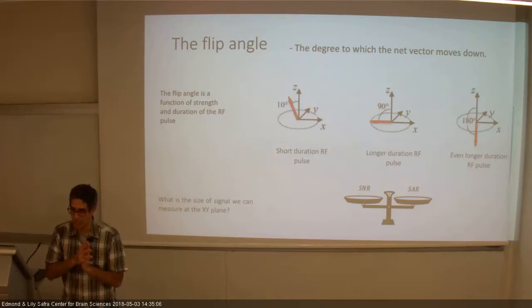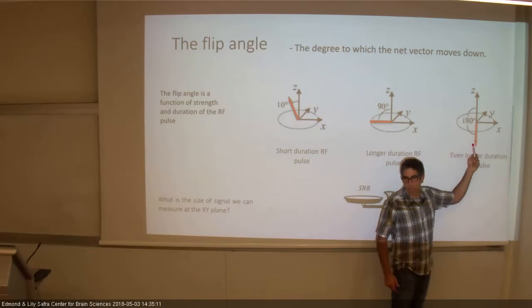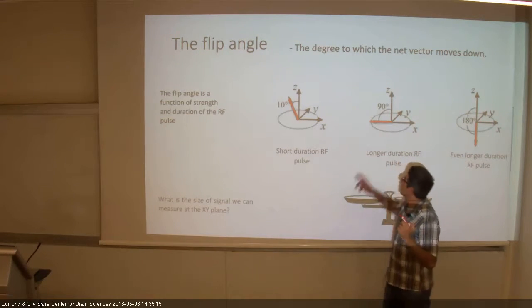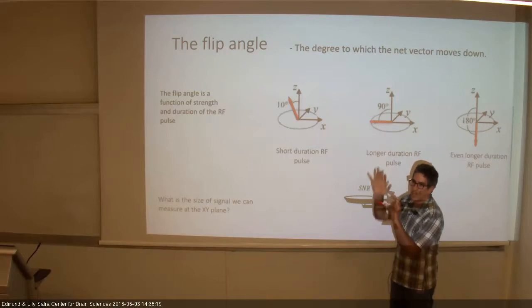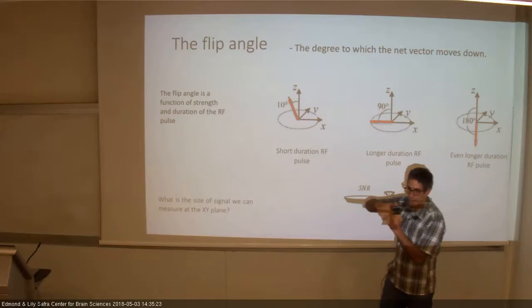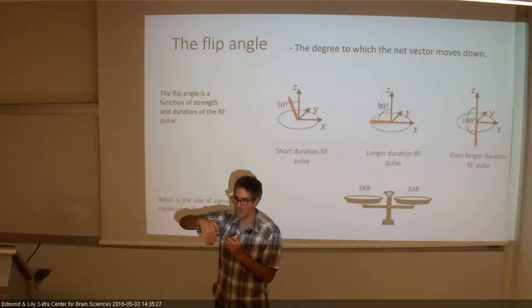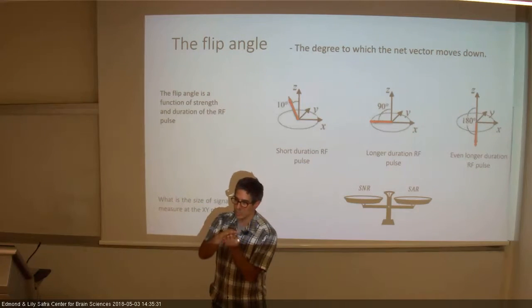Okay, that was helpful. Here is one where this vector is fully projecting to the anti-parallel direction. Sometimes a little bit will happen when this effect is cancelled, and we have only the projection to xy, because I flip enough to cancel the ones that project up and the ones that project down. So there is no difference anymore between the levels, but they're still coherent, so they now project on the xy.